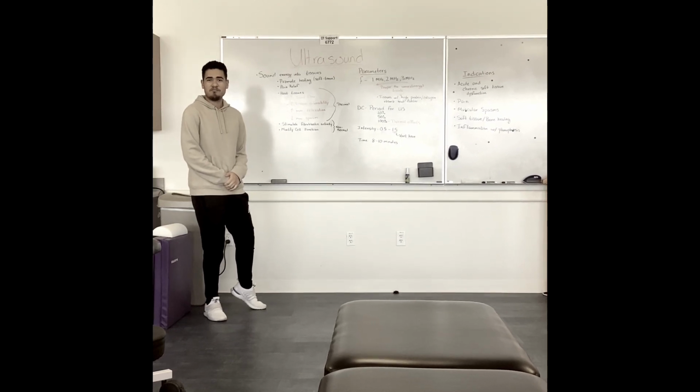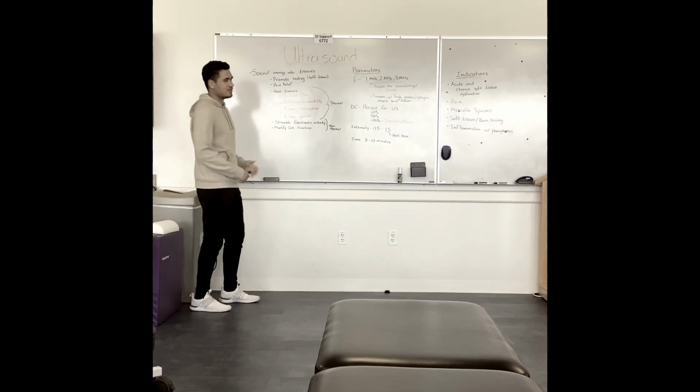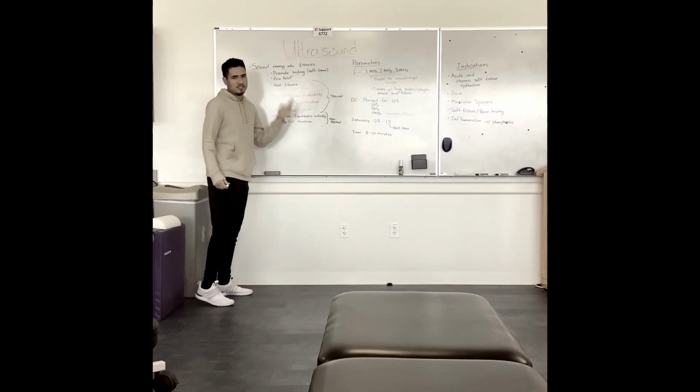Another episode of PT in the Making. So today we're going to talk about ultrasound. So what is ultrasound? In a simplistic form, it's just sound energy into tissues.